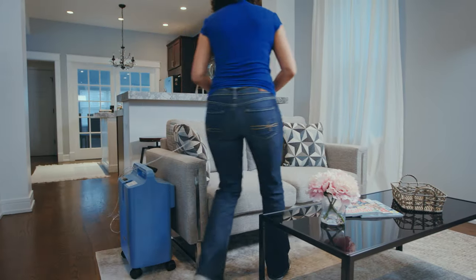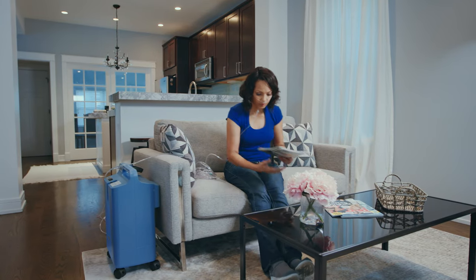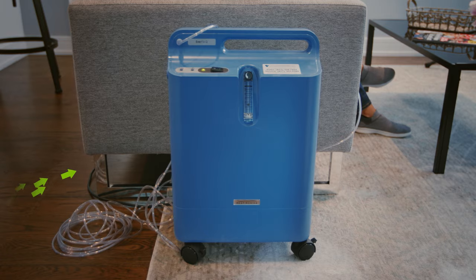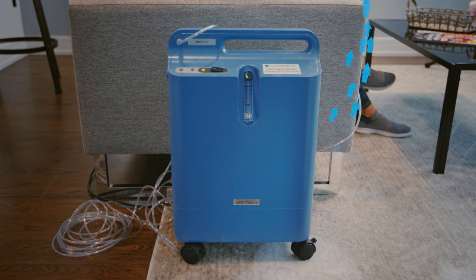Patients who need constant oxygen at home or while they sleep are often prescribed home oxygen concentrators. Oxygen concentrators take air from your surroundings, extract oxygen, and filter it into purified oxygen for you to breathe.